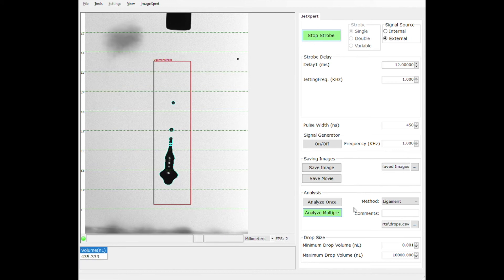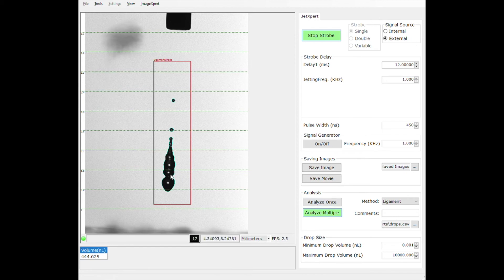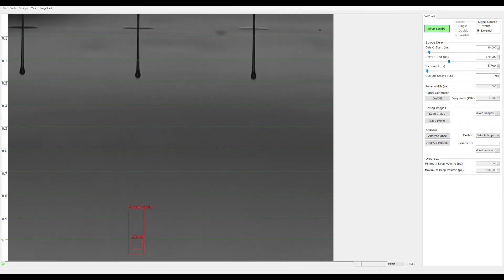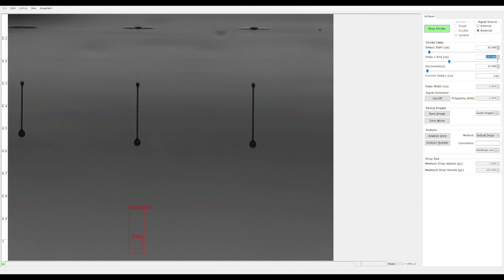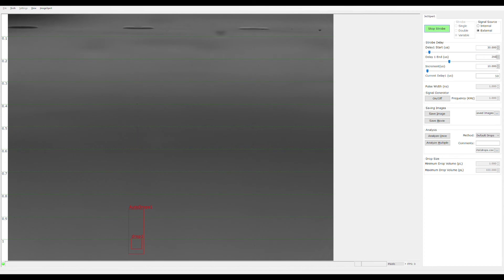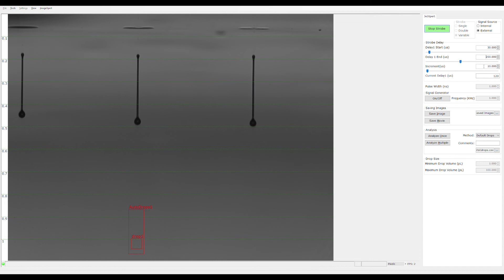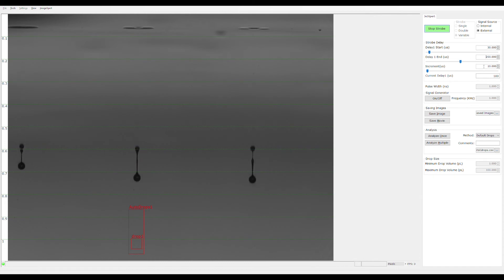Let's take a look at what the drops look like coming from an inkjet print head. The drops that we were looking at before were approximately 400 to 500 nanoliters in size. The drops from this print head are 30 picoliters in size.